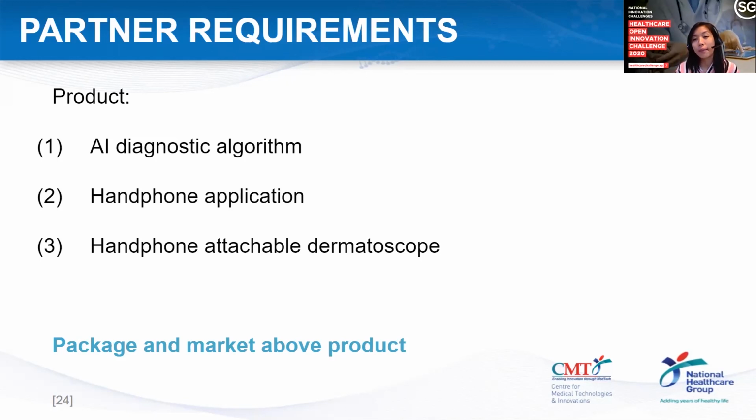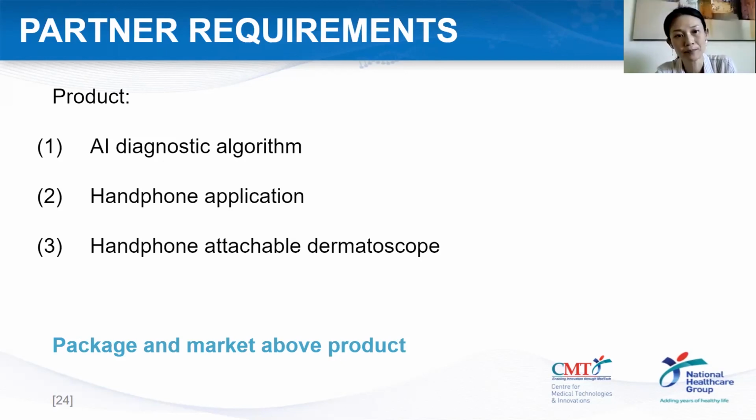Then one question, to get a better understanding for commercialization, is: will there be sample data sets that could be provided, maybe even at the shortlisting stage? Currently, for the dermatoscopic pictures, we're using an online database called the ISIC. It's an international data set with more than 10,000 pictures online, both benign and malignant. You have the benign moles and the malignant melanomas, and we're using that data set to teach our algorithm.